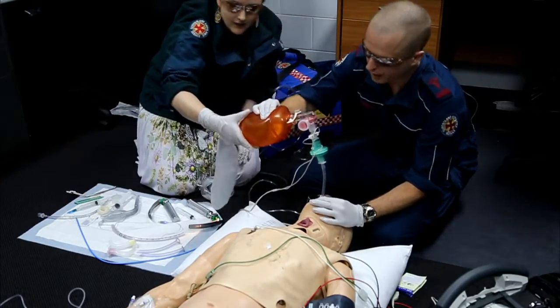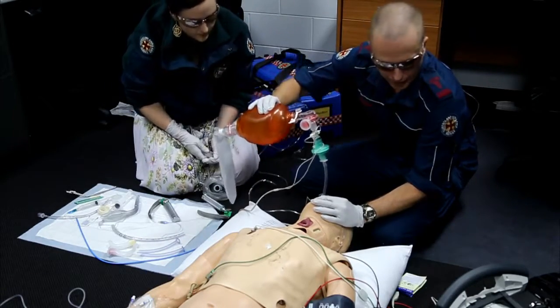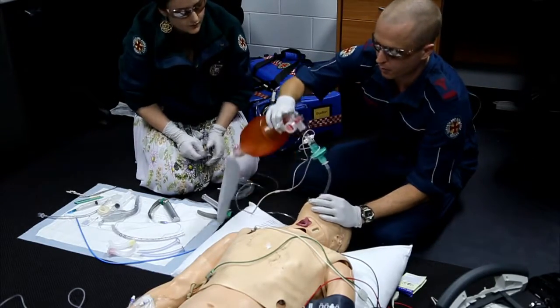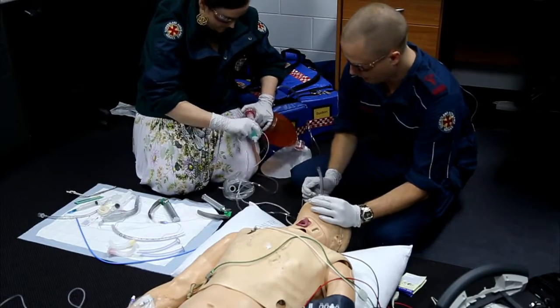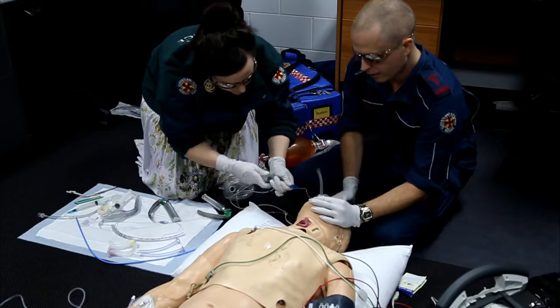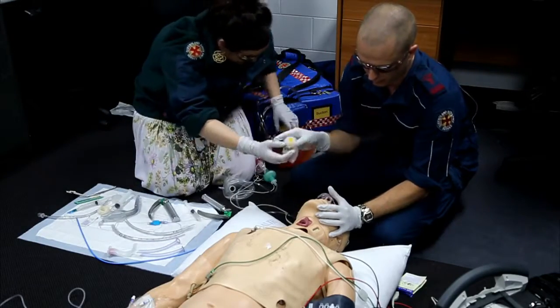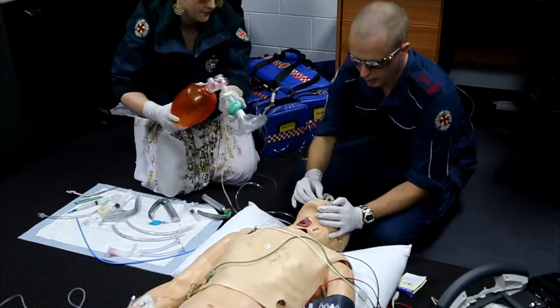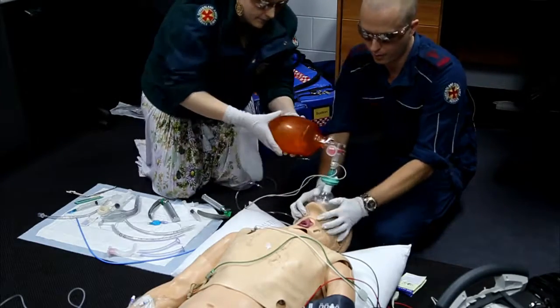Okay. So again, we have no rise and fall of the chest, inappropriate weight on the bag, and no waveform, so that's another failed attempt. I'll get you to pull. Sorry about that. And deflate the cuff. Cuff deflated. Thank you. Okay. I'll just go straight to two person.